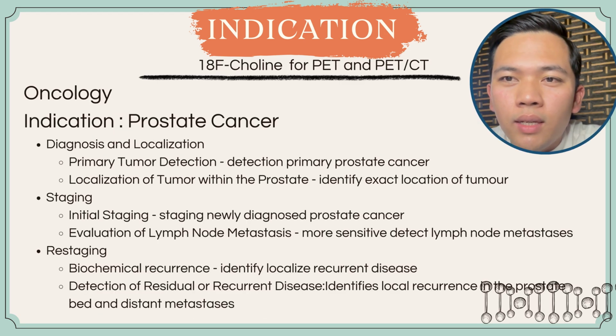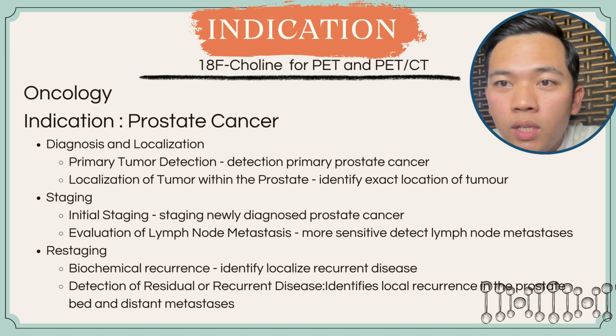Okay, so next we will explore the use of F choline PET and PET CT in oncology, with a specific focus on applications in prostate cancer. The F choline is a powerful imaging technique that helps in the diagnosis and localization of prostate cancer. Okay.